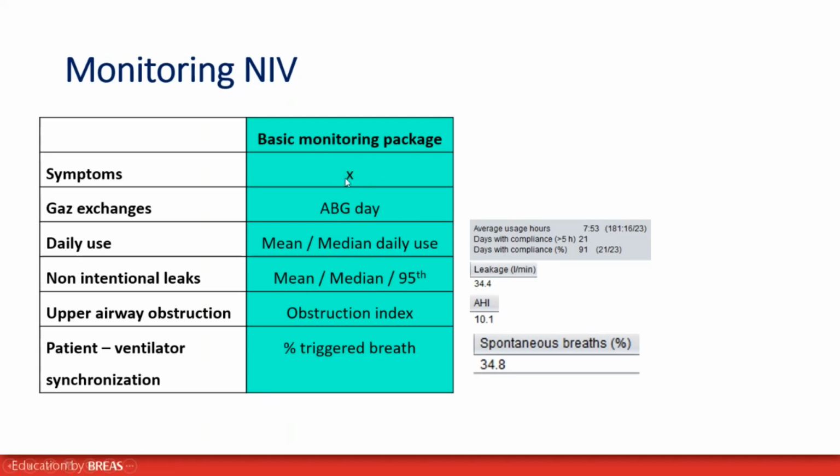So, asking a few questions to the patient to assess the symptoms. You know that a patient before NIV has symptoms of chronic alveolar hypoventilation, and after starting NIV, if we see a decrease or relief of the symptoms, it's a very good signal that the treatment is efficient. But also ask the patient about tolerance. How long does it take to fall asleep at night, in the evening, does the patient wake up, how does he or she feel in the morning, is there headache, morning fatigue, and so on.